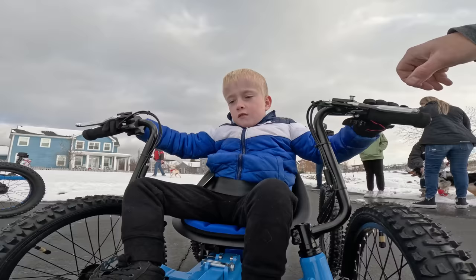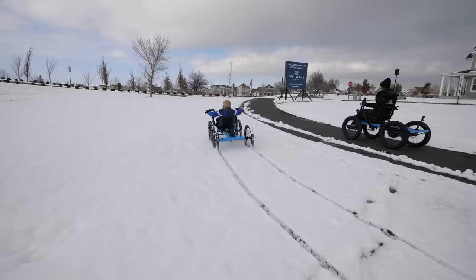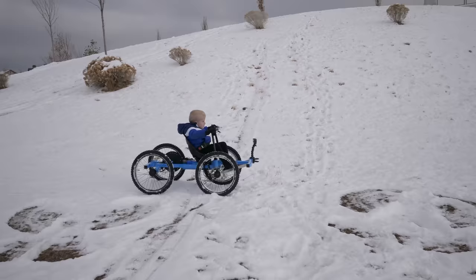Can this go on snow? Yeah, it can. Yes! This is epic. Now I can go as fast as I want. I'll meet you at the playground. This is awesome. This is the craziest thing ever.